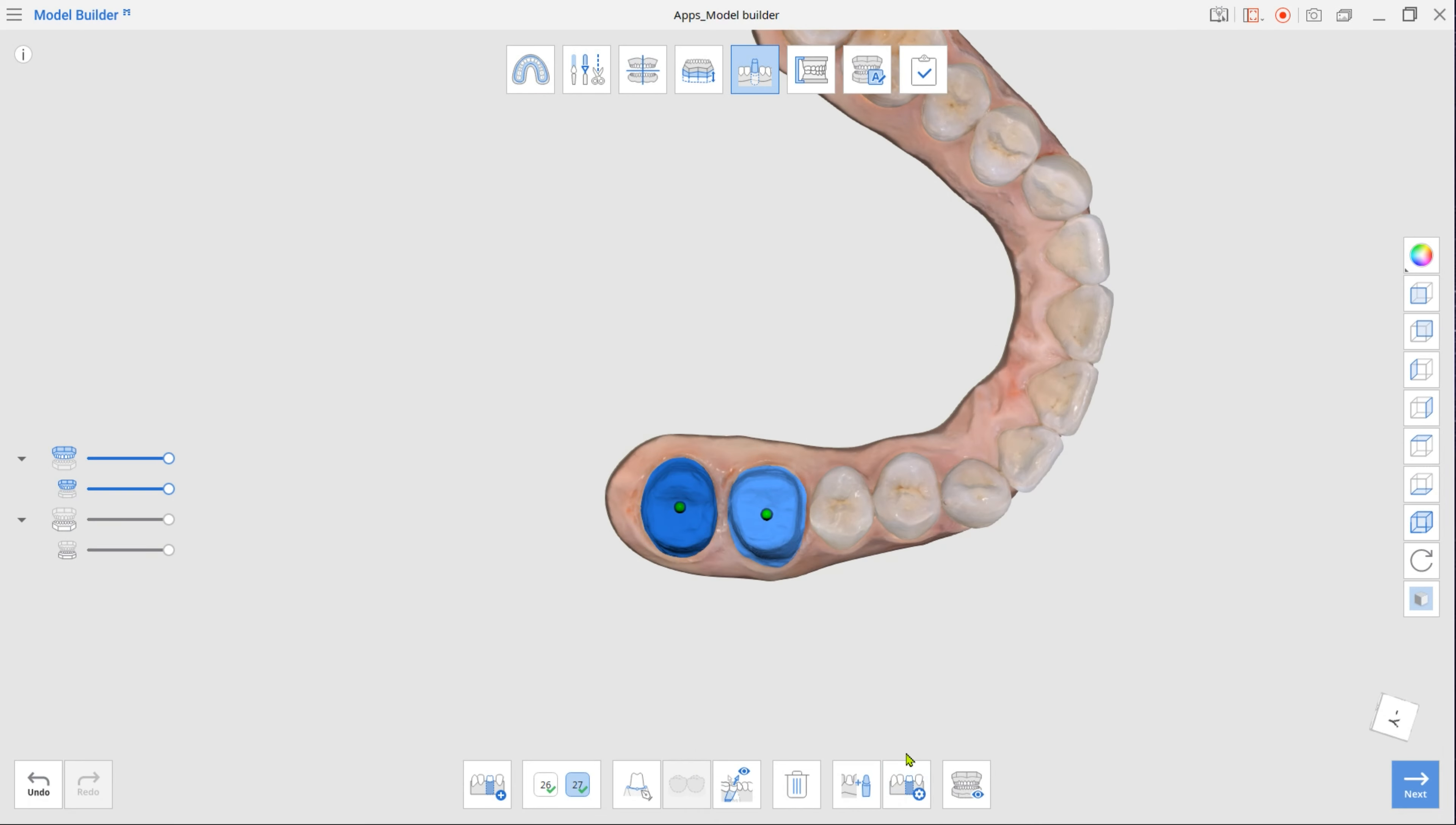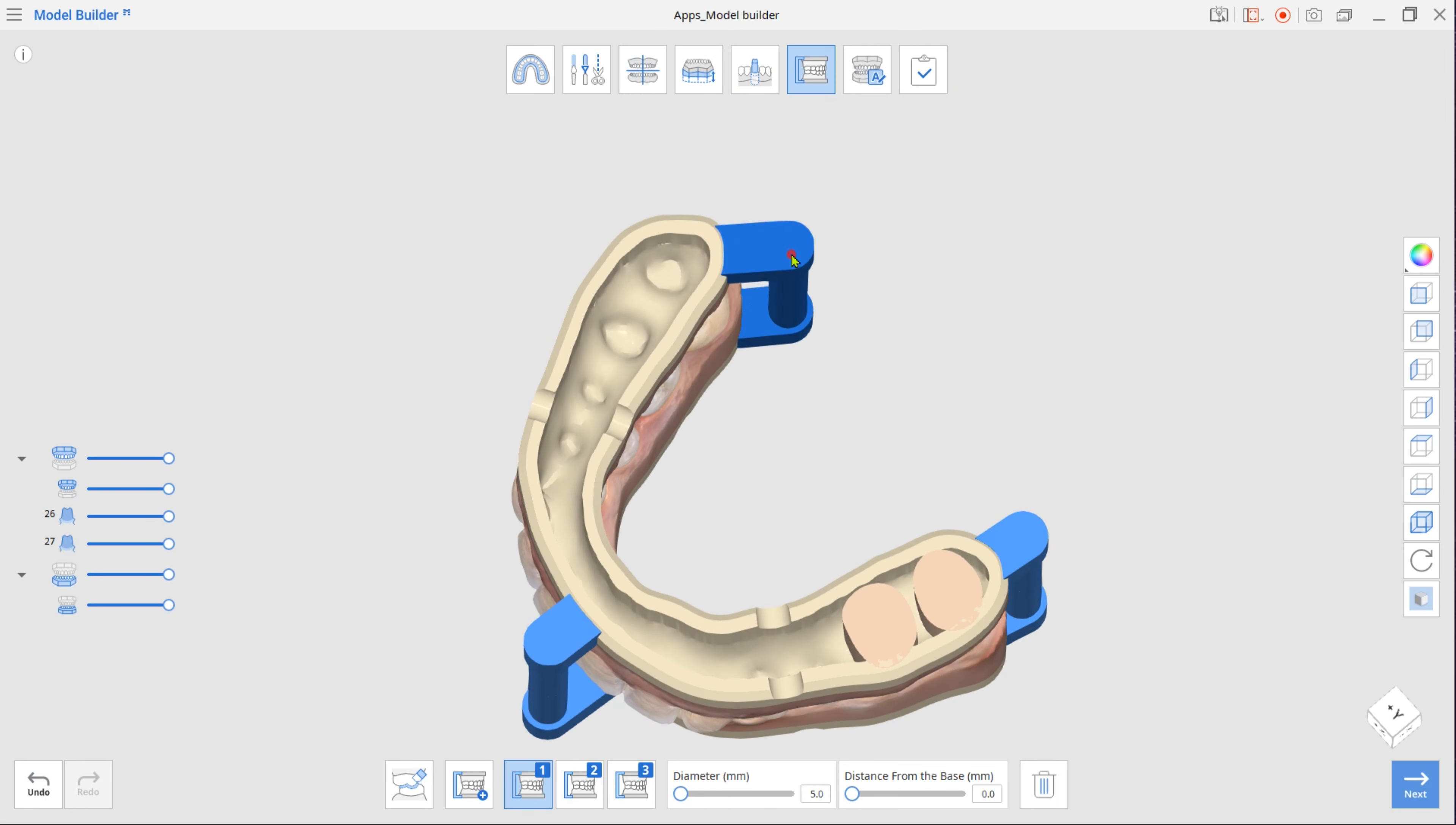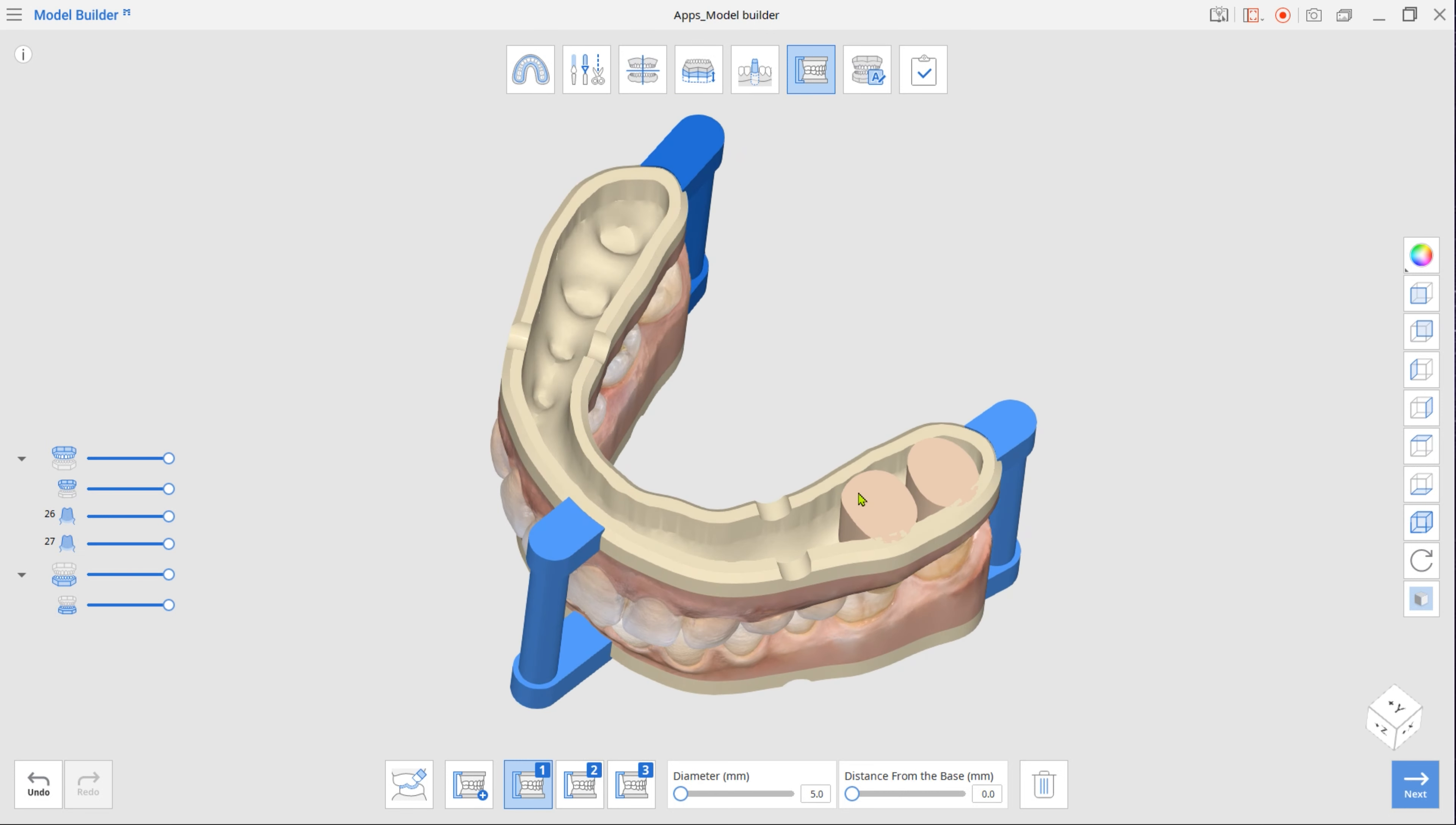Next step is Articulator Mode. The program will automatically attach three articulators. Use the Diameter slider to change their thickness. Click and drag each articulator to adjust its placement.